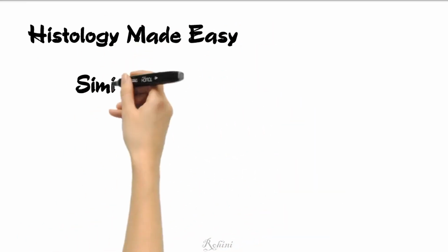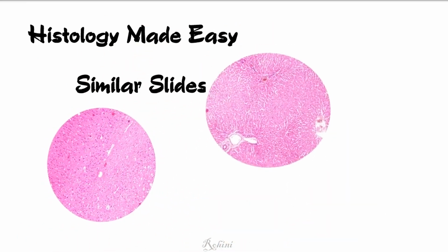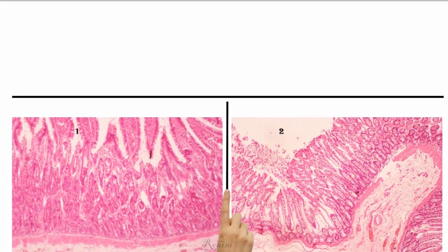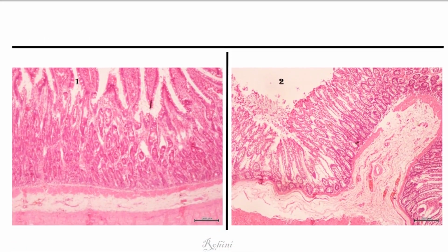Now that we have seen all the slides, let's try to differentiate similar looking slides. Have you tried identifying these two slides?